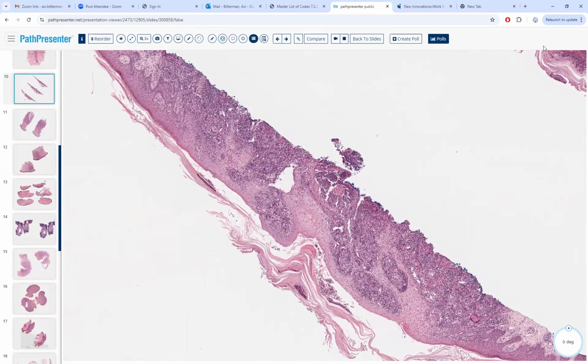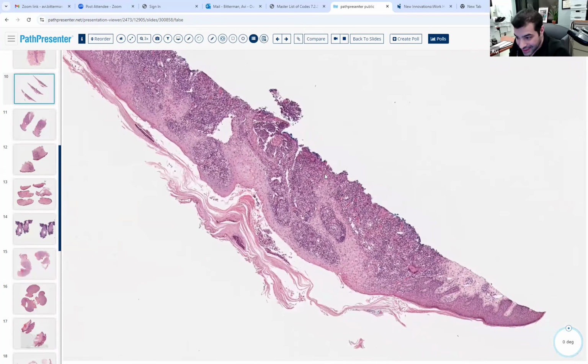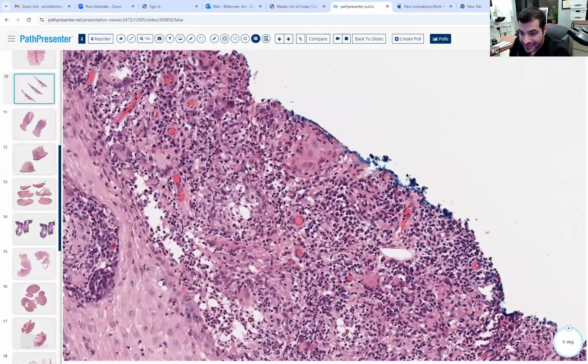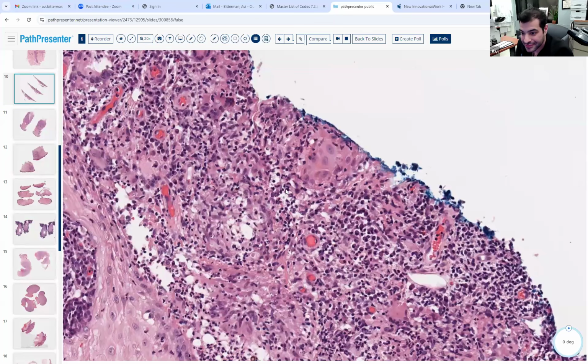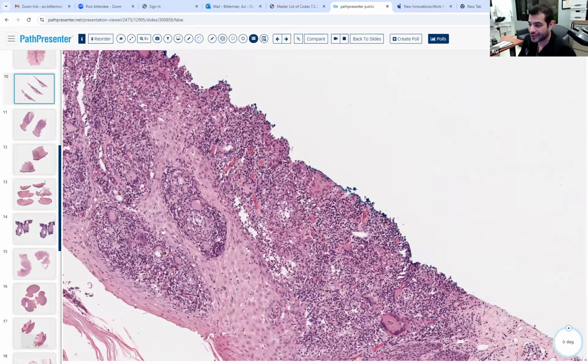This looks follicular based. Is this rosacea, like granulomatous rosacea? Okay, granulomatous. I'm not really seeing the follicular part. There's also something else. There's granulomatous, but what other cell is there? It's actually multiple other cells here. Plasma cells, lymphocytes, and what else? What are all these? Neutrophils, numerous ones of these. So when we have granulomatous inflammation with neutrophils, what do we call that?